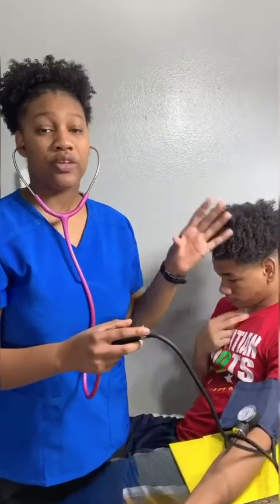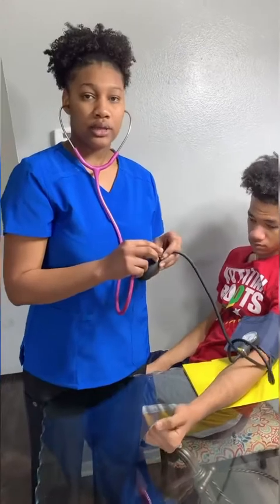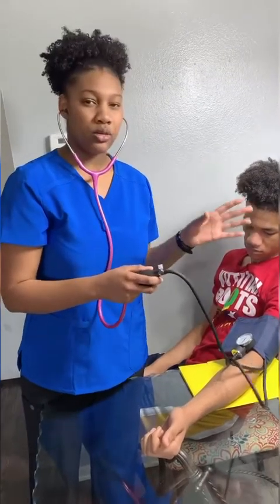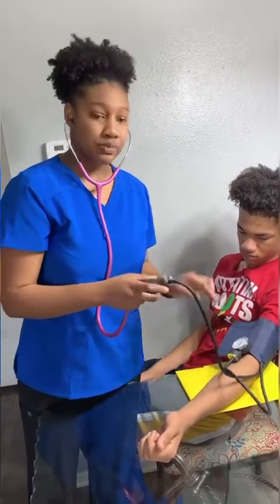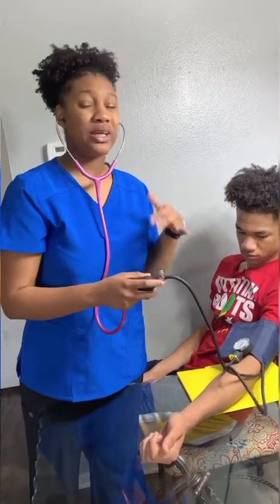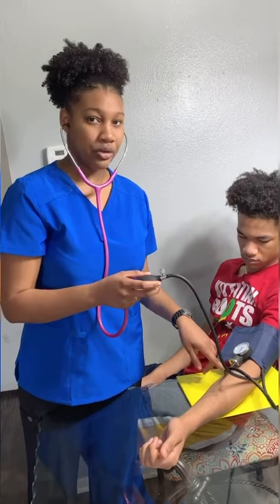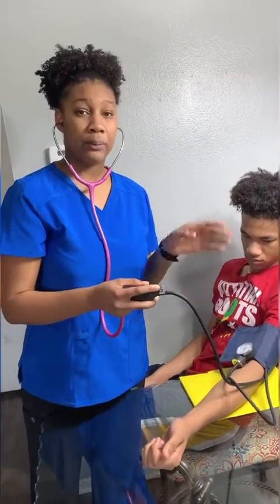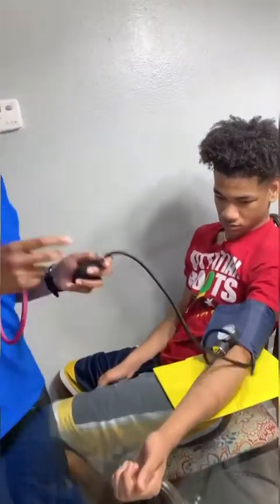Now, when getting the pressure, you look for the systolic and the diastolic pressure. I'm going to turn the valve clockwise, and I'm going to inflate it between 180 and 200 millimeters of mercury. Then I'm going to turn it anti-clockwise, releasing 2 millimeters of mercury at a time. The first beat that I hear will be the systolic pressure, and then no sound, that will be the auscultatory gap, and then the last beat I hear will be the diastolic pressure. Okay, so right now that's what I'm going to do.